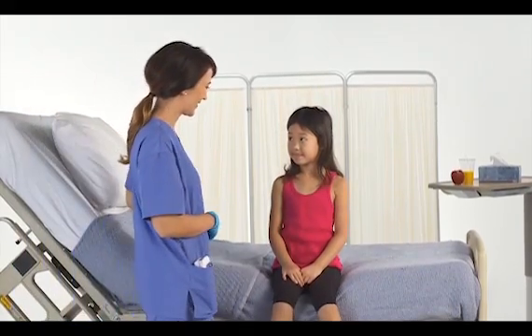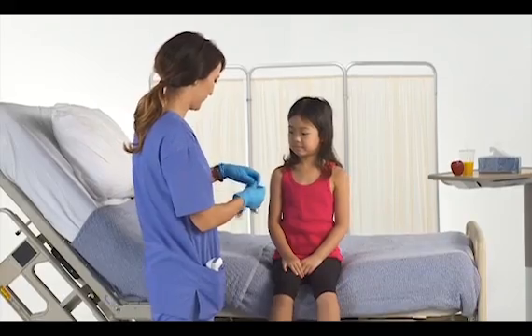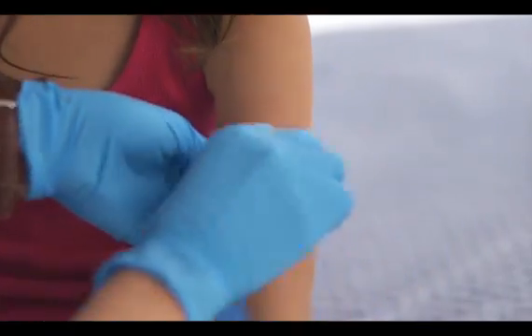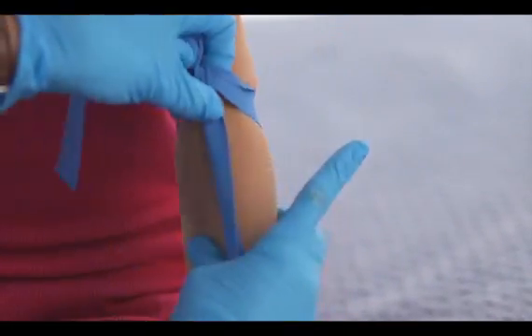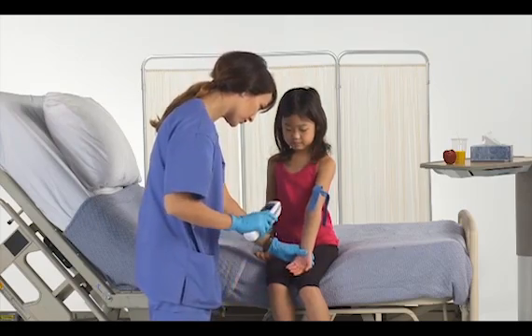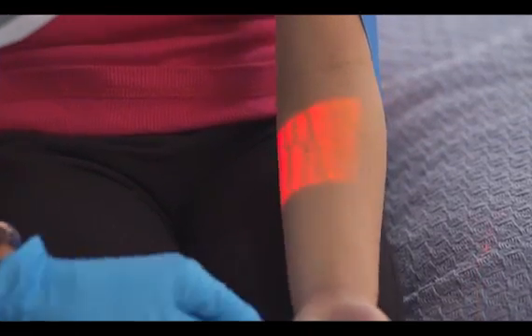The AV400, used in conjunction with standard venipuncture techniques, can help you visualize additional veins. When performing venipuncture procedures, always place the tourniquet on prior to assessing with the AccuVein AV400. This will allow blood to fill the veins for optimal visualization.